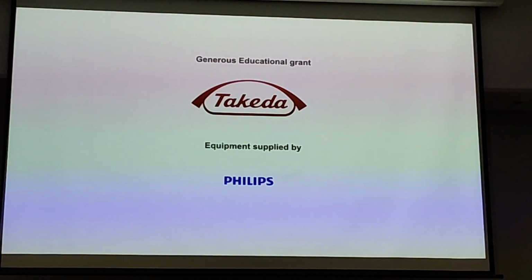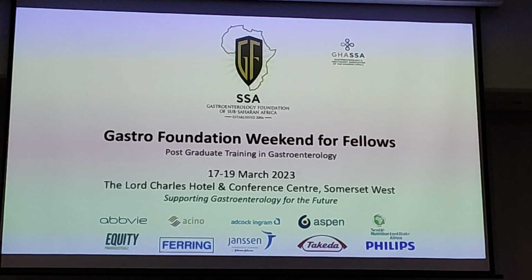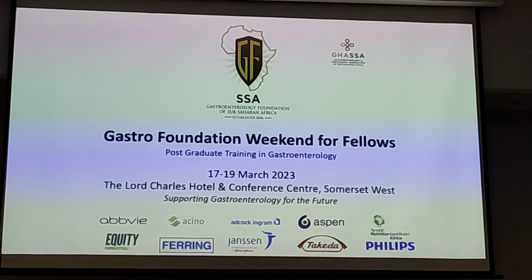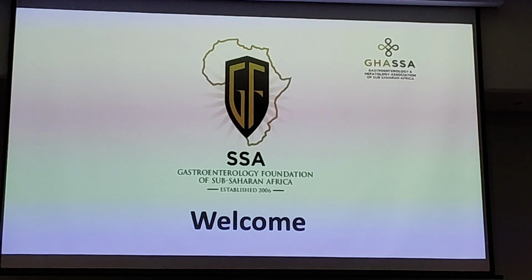Because it's no histology. But what comes is that there are ultrasound, so sort of antibodies against tumor antigens that have gas bubbles, and they bind to those antigens, and so they are like contrast agents that you can use in ultrasound, more specific as compared to the ones that we had in the past. But this is a little bit sophisticated, and development is going on, and we have to see what happens.